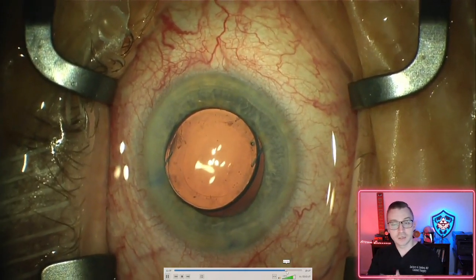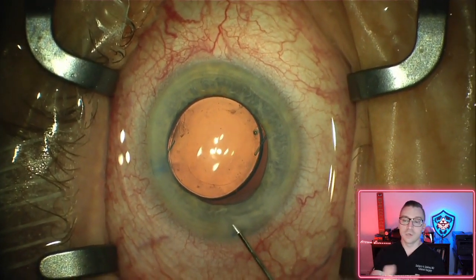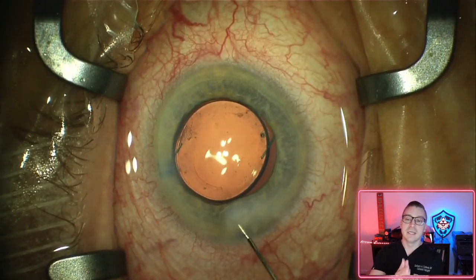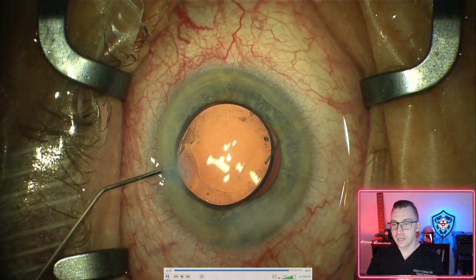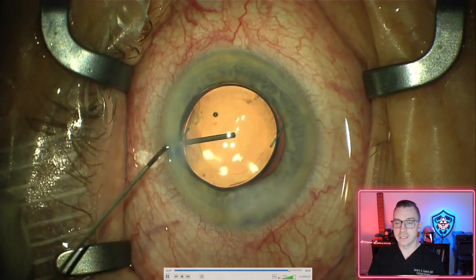Now, this incision is not going to require any stitches. We're just going to use a little bit of saline to hydrate the cornea, make it swell up just a little bit, and that's enough to have those edges of the incision sit down together nicely, and this patient's not going to require any suture at all. And that is pretty well the end of it there, guys. I'll put a little bit of antibiotic into the eye here.